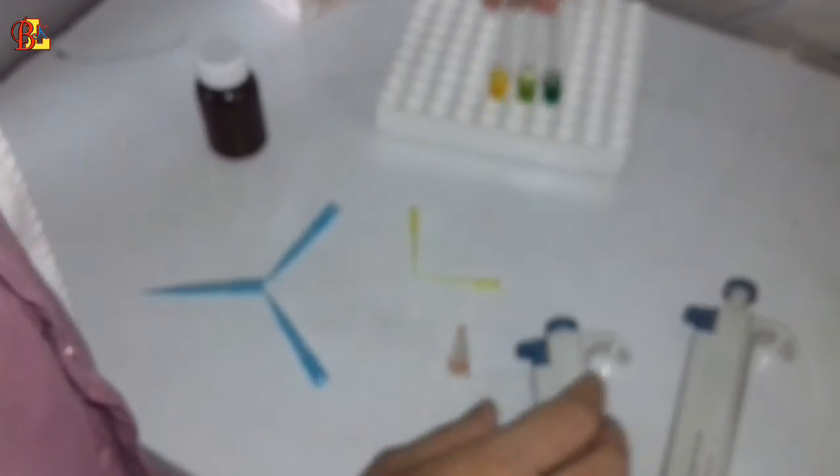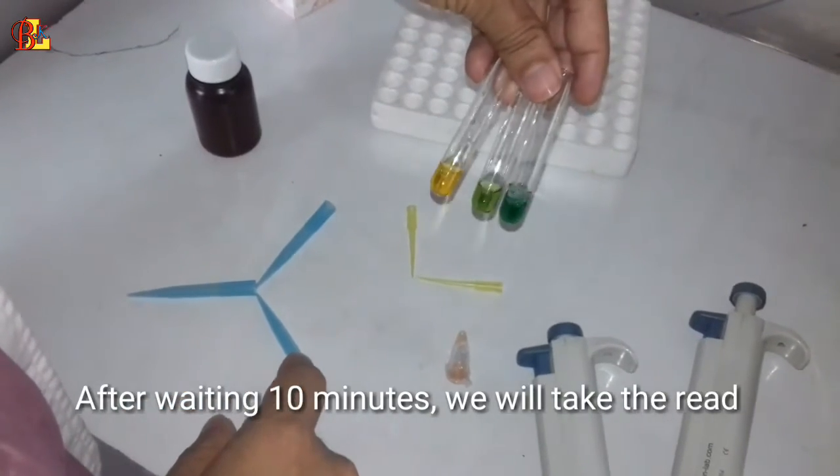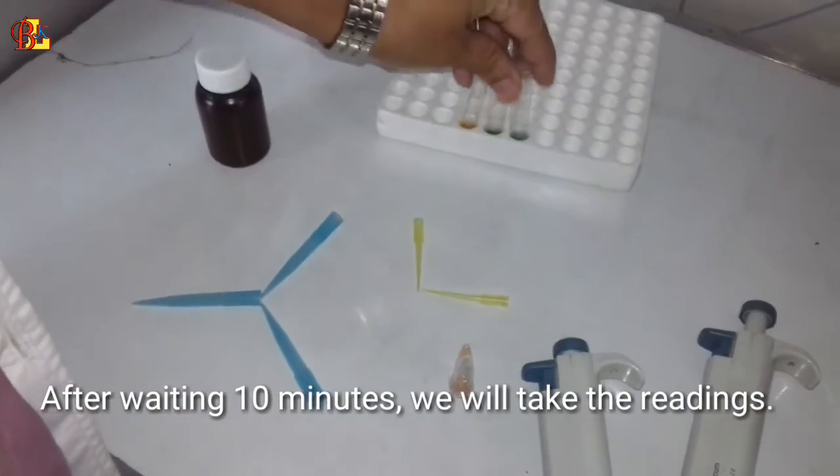Now we wait for 5 minutes at 37 degrees centigrade temperature, or wait for 10 minutes at 15 to 25 degrees centigrade temperature.